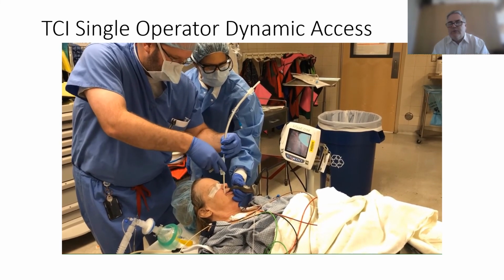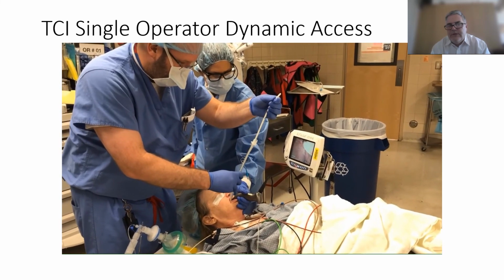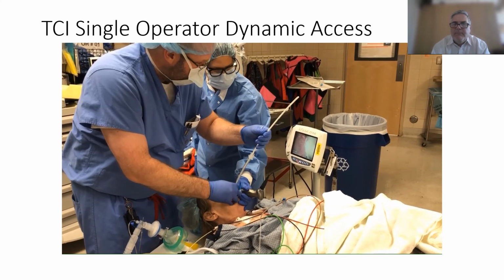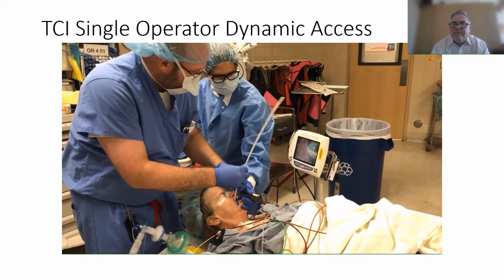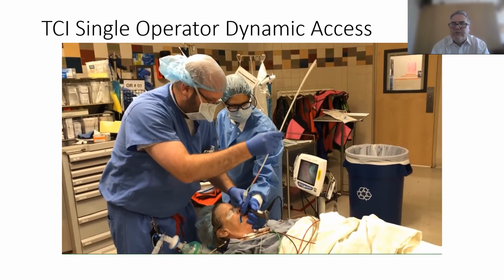The video laryngoscope's handed off to the nurse so that the tube entry can be seen indirectly, and the patient's intubated. Very smooth, very easy, very fast, low stress for the operator, low trauma for the patient.